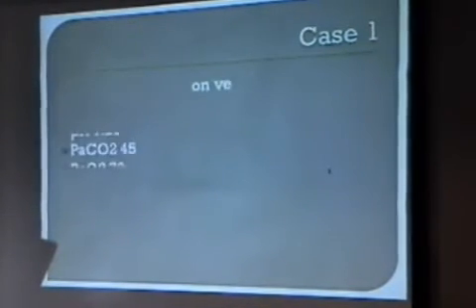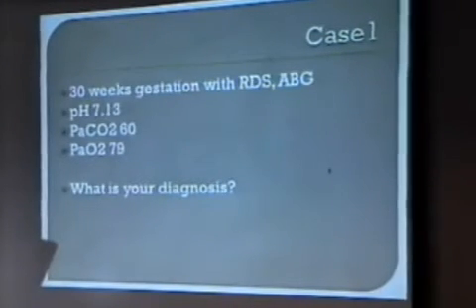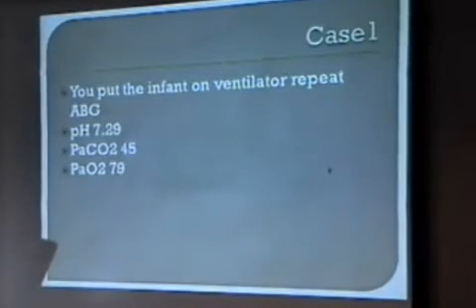This was his first gas. He was sick. Okay? You put him on a ventilator and you improved him. Right? Now his pH is better, his PCO2 is better.